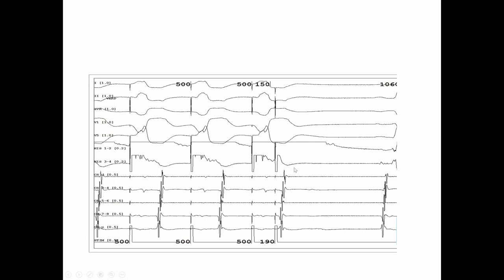until finally we don't actually reach ventriculo-atrial nodal ERP, we've actually just reached ventricular effective refractory period. So it hasn't captured the ventricle at all here. But this is an example of normal concentric decremental VA conduction. And the yellow is where there should be the next ventricular captured beat that it hasn't actually captured because it's reached its refractory period at 190 milliseconds.